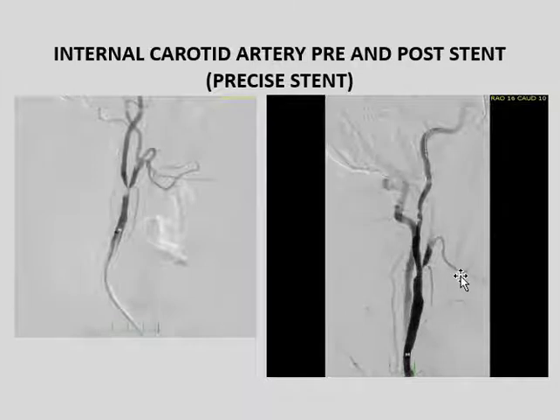areas like the jaw. And you can see that even though the vessel is not evenly dilated all the way through, this is a special type of stent called a self-expanding nitinol stent, meaning it is not balloon dilated when it's deployed, although it can be post-deployment, but that nitinol material will continue to expand marginally, maybe another 10-20%, and in a few days, that vessel would look probably very even all the way down. The important thing is we have alleviated that tight stenosis at a critical point and restored normal perfusion to the brain, minimizing the risk of a stroke.